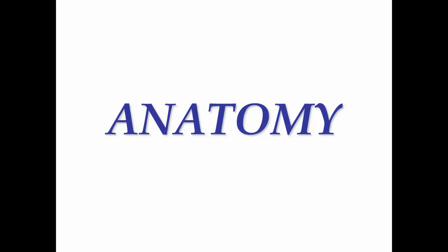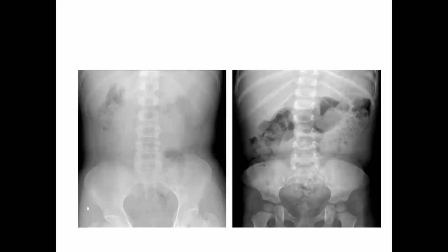Okay, with this background knowledge, now let's put this together, see a few cases before we go into the actual cases. Okay, so this is an X-ray of the abdomen. We have covered the KUB area. We have the kidneys here. This is in the lumbar region. The ureter is supposed to lie overlying the transverse processes, and the bladder is here.